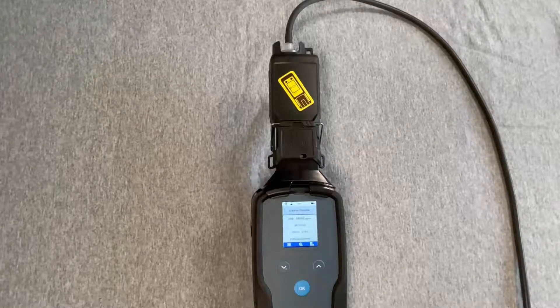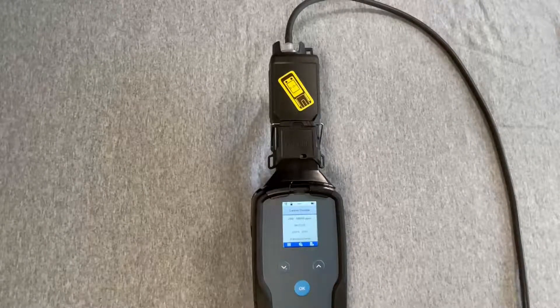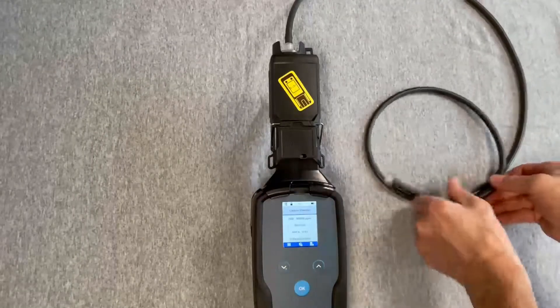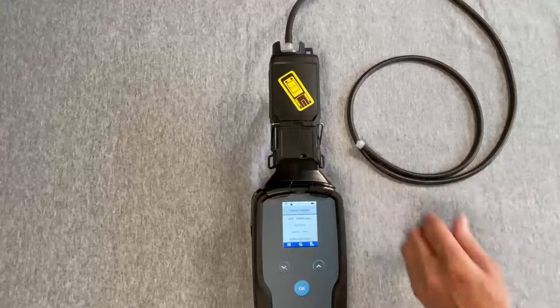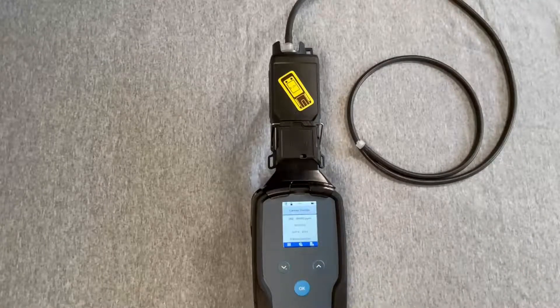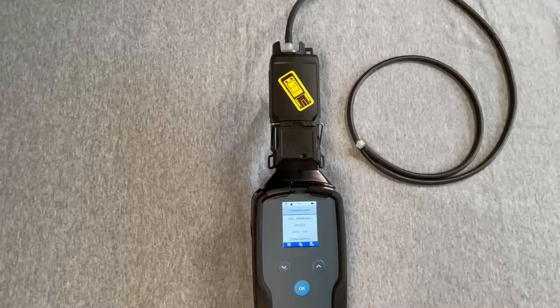Next, remove the end of the extension hose and allow the pump to clear the hose for about the same amount of time that it was used to flush. At this point, press the down arrow to access the menu and turn off the pump.